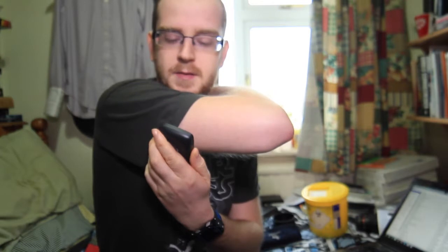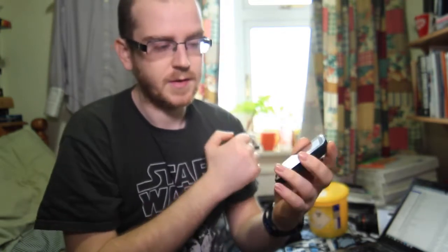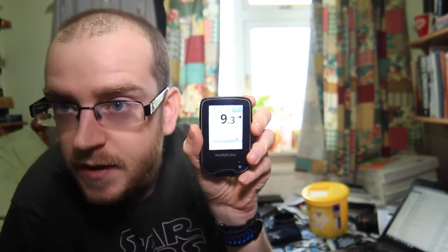It's been about an hour now. I'll see if it reads through the fabric — going to scan with the reader. Pressing the button first and scanning. There we go — my blood sugar at the moment is 9.3 mmol. A little bit higher than it needs to be.